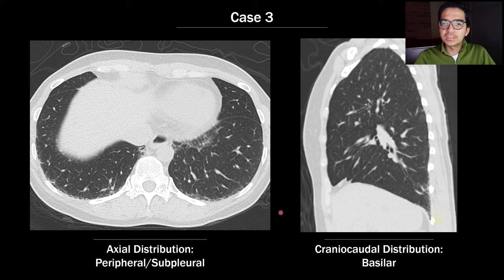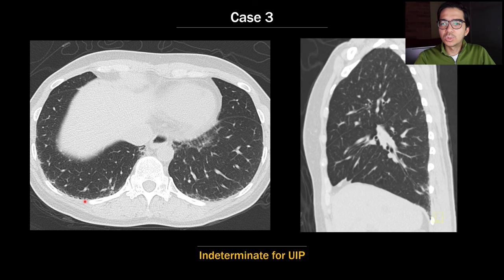In the third case, we have peripheral or subpleural fibrosis that is basilar predominant, but the degree of fibrosis is very mild. There is no honeycombing, just a bit of ground glass and reticulation — it's just not enough disease to meet the threshold. I would call this one indeterminate for UIP.